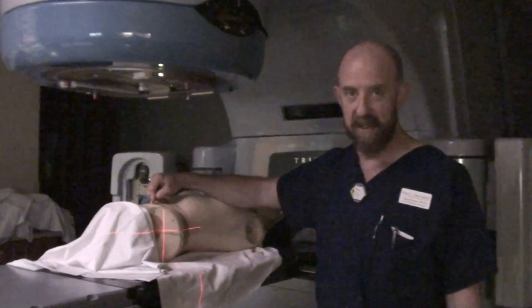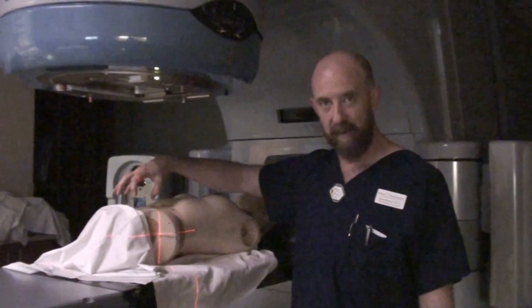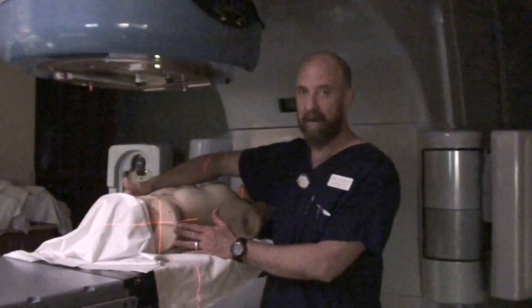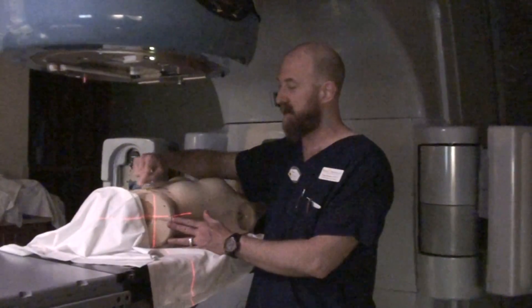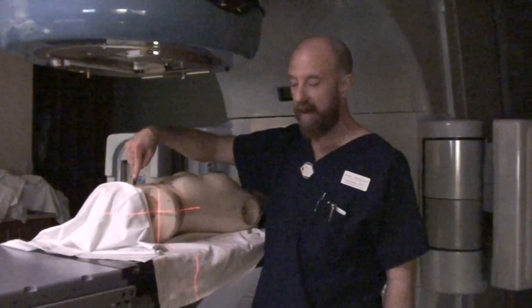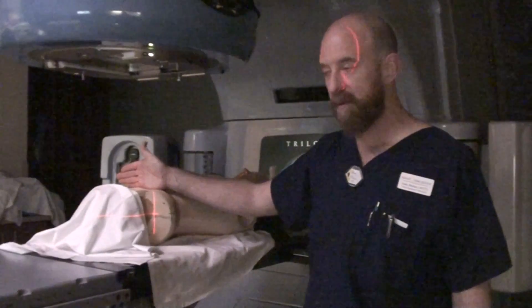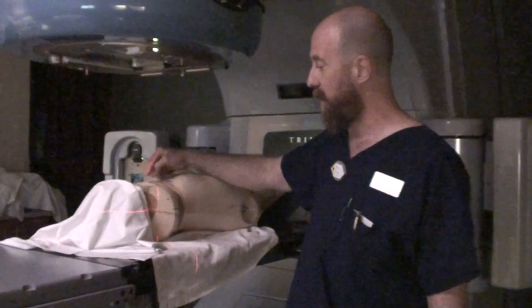A lot of times what you'll end up with is a mark superior to the CR, somewhere toward the top of the field. You can use that mark for left/right only, because you know you're going to use the laterals for in/out and up/down. Even if it's five, six, or seven centimeters superior to where your CR is, you can still use it — somewhere up above where it's more reproducible and more visible to you — you might have just a left/right tattoo or mark.